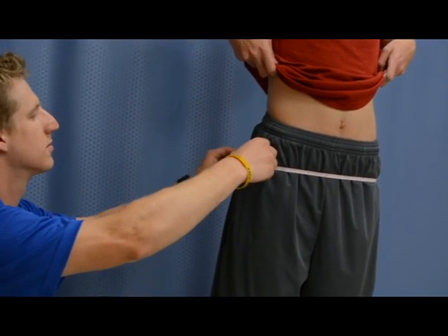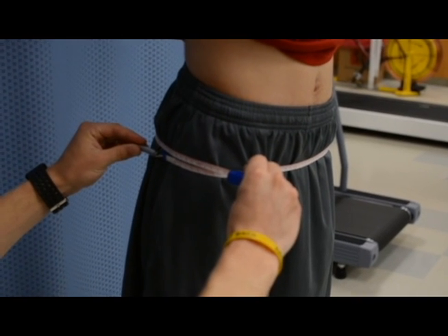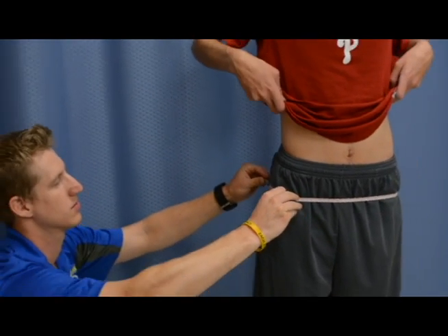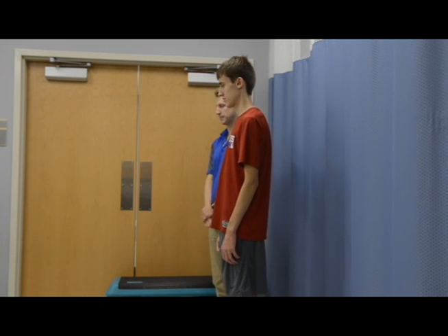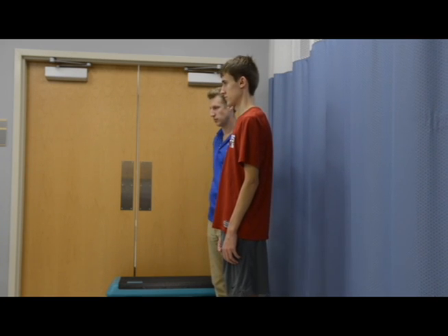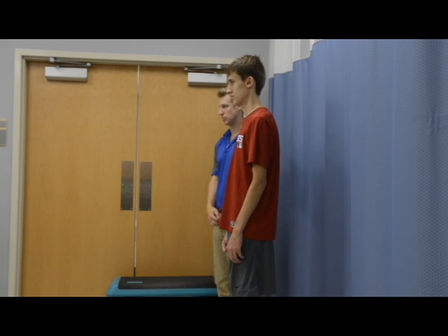Once you reach the start point, apply some slight pressure with the tape to slightly compress the area to make sure that the measurement itself is accurate. Once you've gotten your measurement, you can release the tape. And again, you're going to repeat these measures, once at the hip, or once at the waist and once at the hip. You would then have 2 measures at each site. Make sure that they are within their 5 millimeter difference. If they are, no more measurements need to be taken. If the 2 measurements at each site are greater than 5 millimeter difference, you may need to repeat one of the sites.